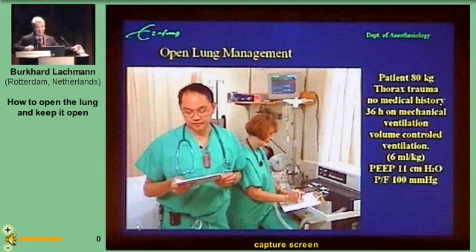That was about 30 minutes ago, and right now his blood pressures are running about 110/75, and his EKG is normal. I think he may be able to handle the recruitment maneuver again, but I wanted to touch base with you on the phone to get a little help. Okay, I understand your problems.